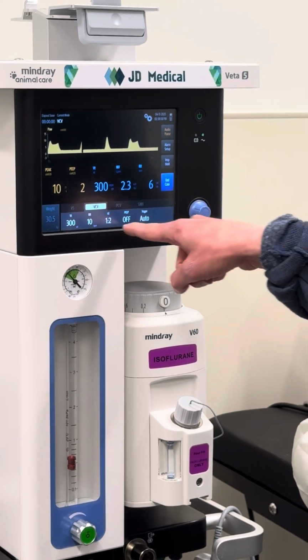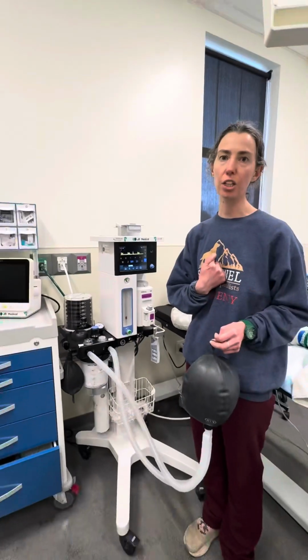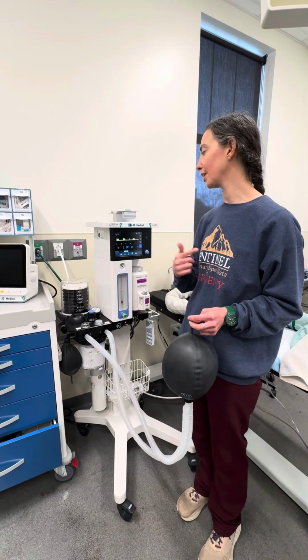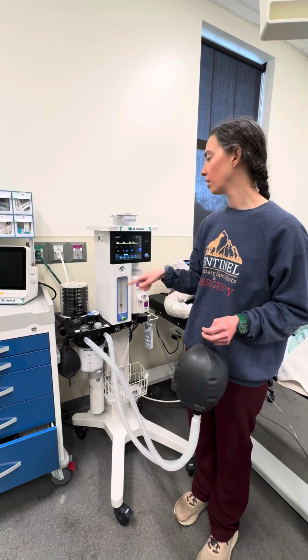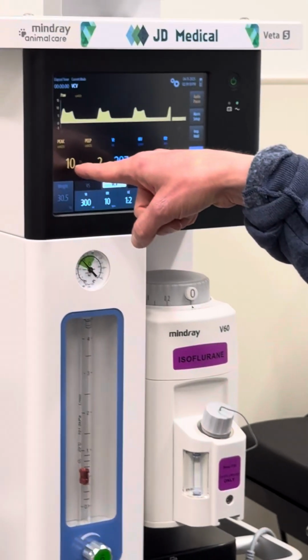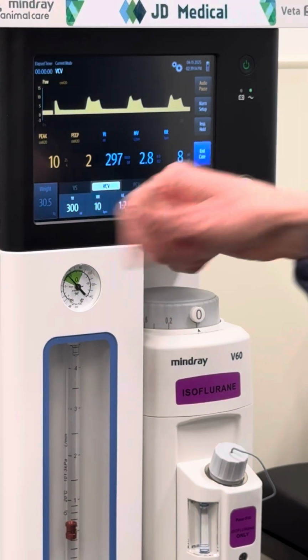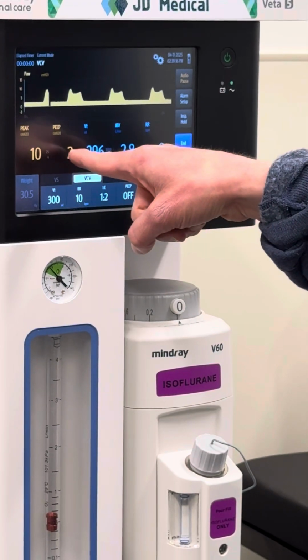So down here is what you're asking the ventilator to do, and then the ventilator is actually talking back to you and telling you what it's doing. So the numbers up here in orange and blue, it's telling you what the peak inspiratory pressure is, which is about 10 centimeters of water. Great, that's where we want it.